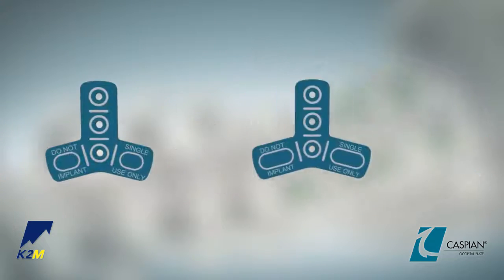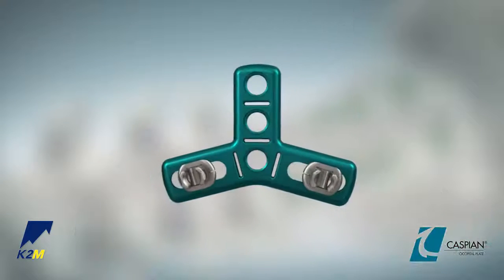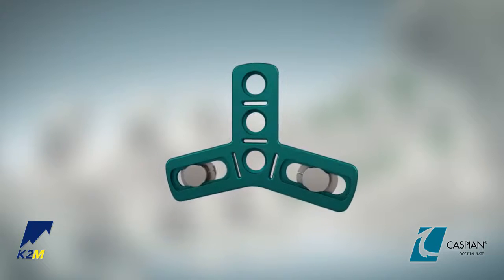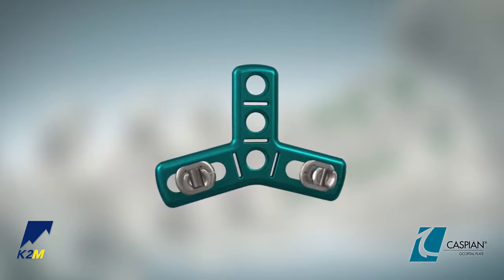Utilize the occipital plate templates to select the plate most appropriate for the patient's anatomy. Because the occipital plates feature TieFix, the screws will not lag the plate to the bone before locking to the plate. Therefore, plate contouring is important prior to screw insertion to ensure the plate lies flush against the occiput.